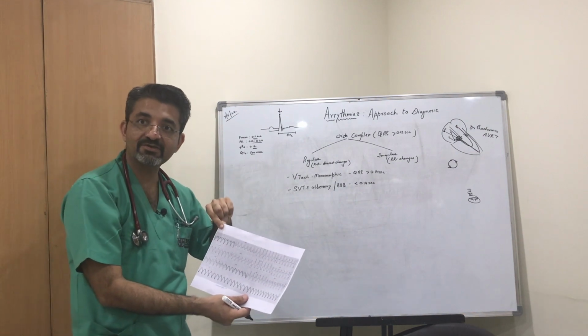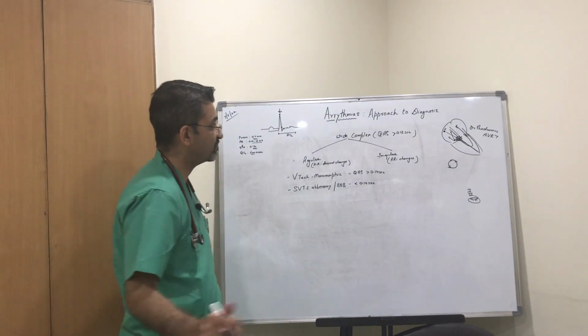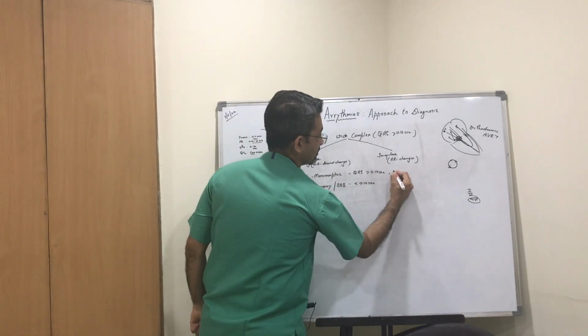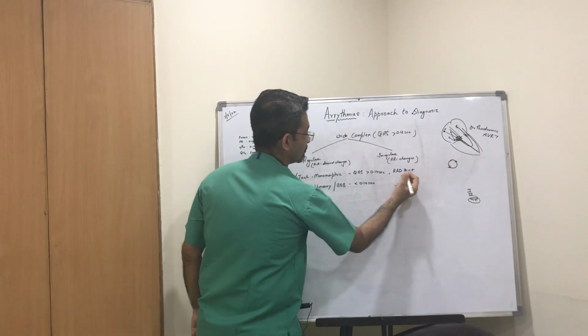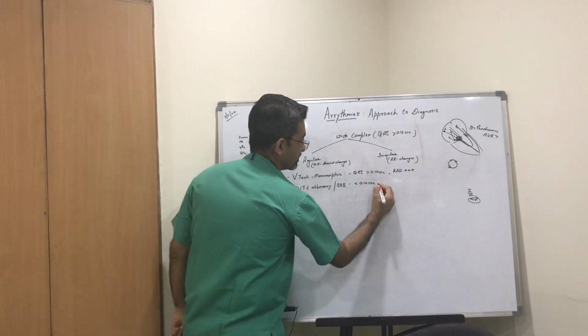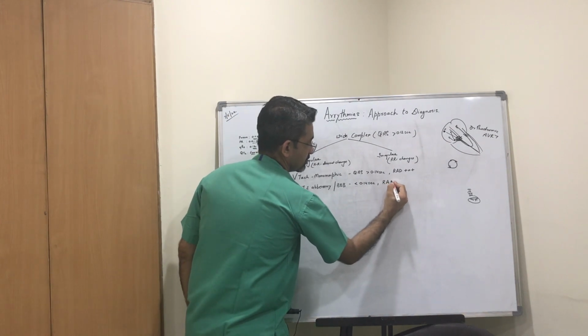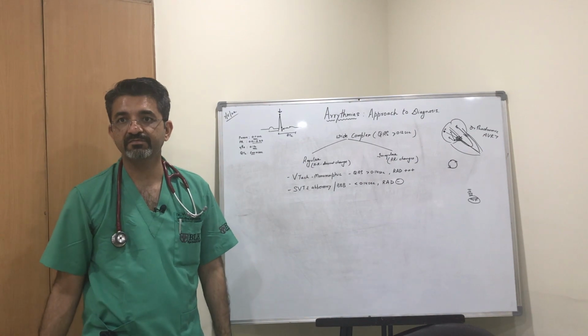If on the ECG you see lead 1 and aVF favoring extreme right axis deviation, it is VTach, which is monomorphic. If there is no right axis deviation, it is SVT with aberrancy.